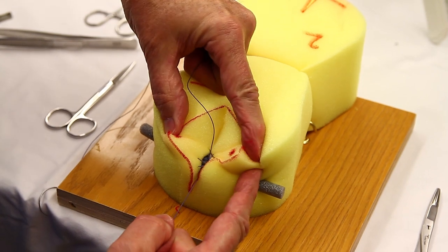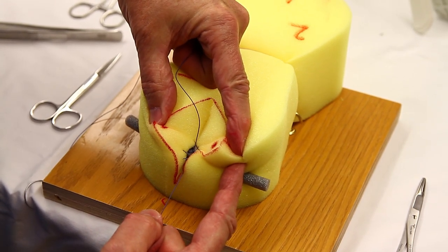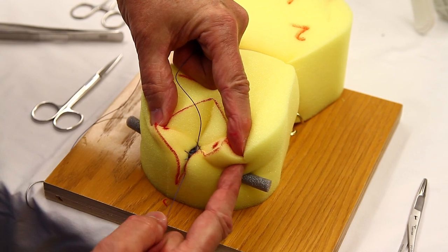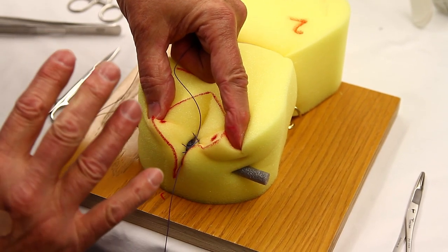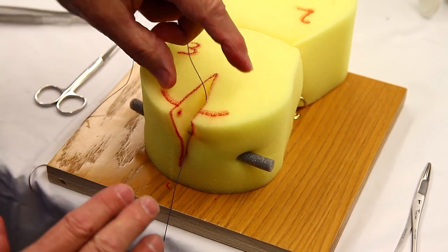And I'll not lock it because I want to save the suture. And now you've turned it into a second degree repair, which is very easy. We just demonstrated it on the other side. So the point is to convert a third degree repair into a second degree repair. And you already know how to fix that. That's the only difference for this portion.